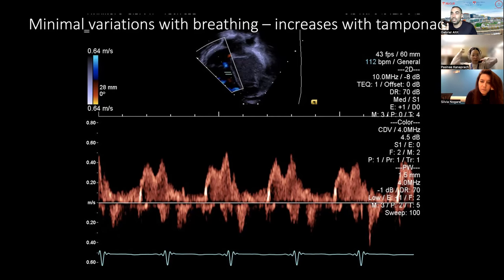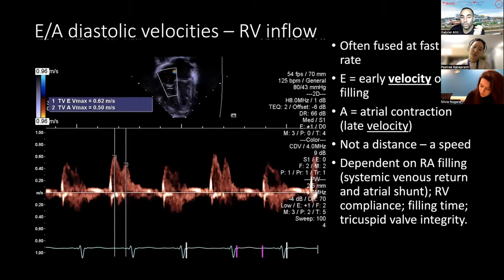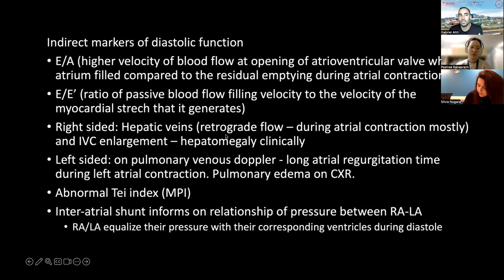And it's similar to the ECG. When you get an electrocardiogram and your T wave in V1 is positive in the first few days of life, but starting at 5 days of life, you should always have a negative T wave in V1, always, always, until you're the age of about 5 to 7 years old. So the same, because the RV remodels and in the first few days you have a bit of RV predominance, but starting like 5 to 7 days of life, you're supposed to have a higher E to A wave. But in the first few days of life, you can have a reversal of this pattern and it's completely part of normal because your PVR are still adjusting.